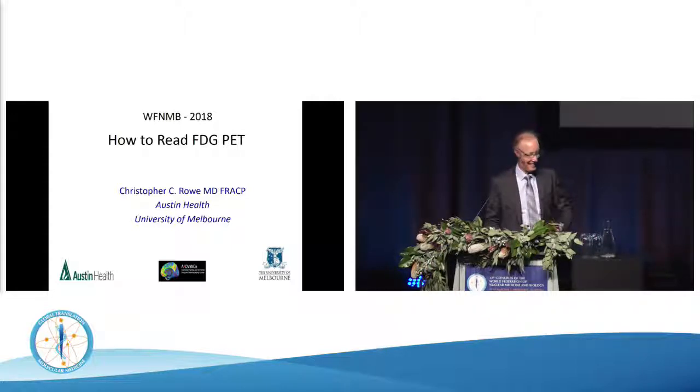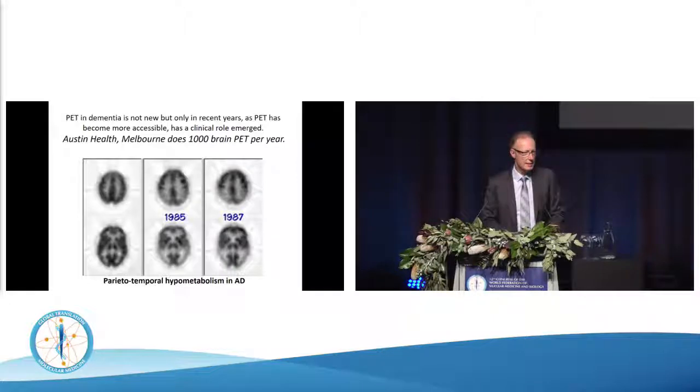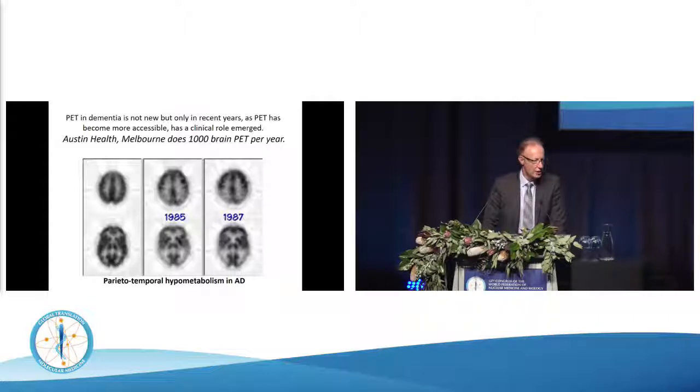Okay, so FDG PET, an oldie but a goodie, and I'm going to just go through how I read them. It's not that FDG PET's new. It's been around, as we heard in previous talks, from at least the mid-80s. Here are some images from 85 showing progression in a patient in 87.